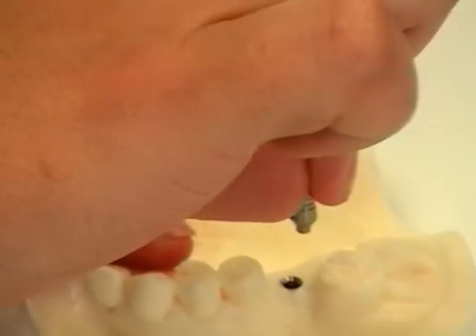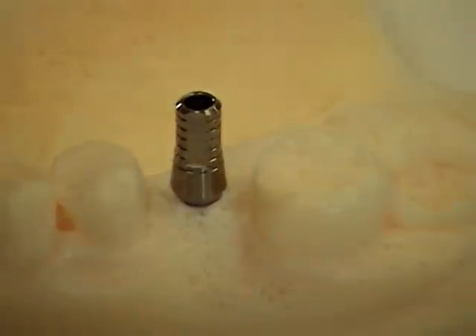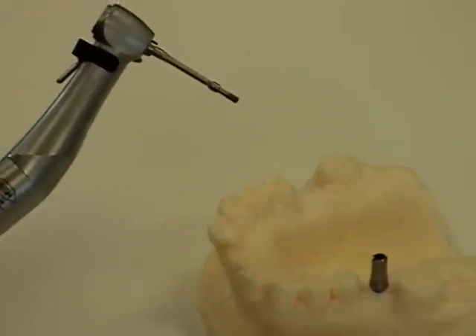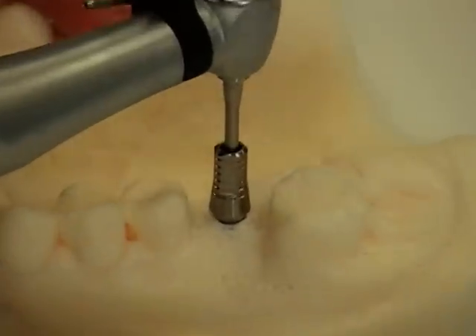We put the abutment in the correct direction, then attach the screw to the end of the driver. You'll notice that it remains in place. The screw goes inside, and we begin the motor.